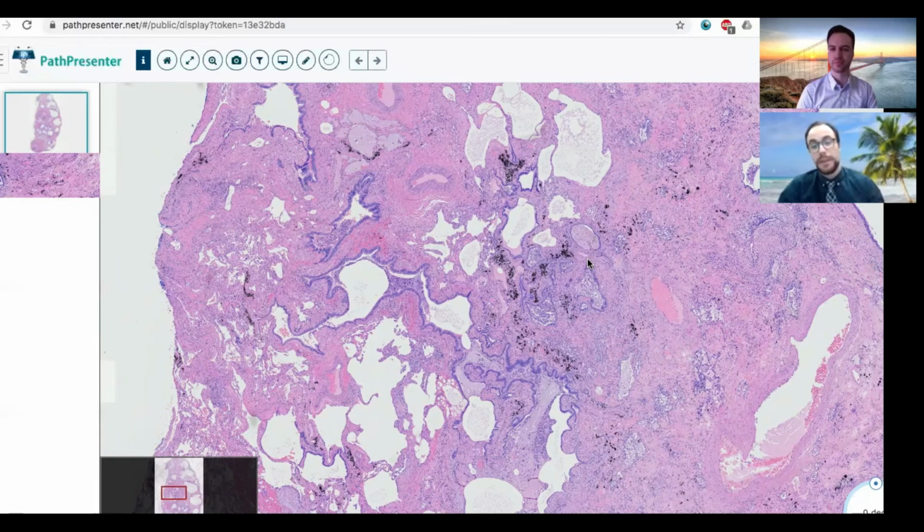There can be a patchy process, and so the ideal place to take a section from is actually at the interface from the fibrotic and the uninvolved lung. And so that's where it can be really challenging to diagnose, especially if they just get end-stage lung. And so they actually don't want to biopsy the worst part. You really want that interface between normal and abnormal lung, which allows you to see some preserved lung and those fibroblastic foci. They're really nice to make the diagnosis.